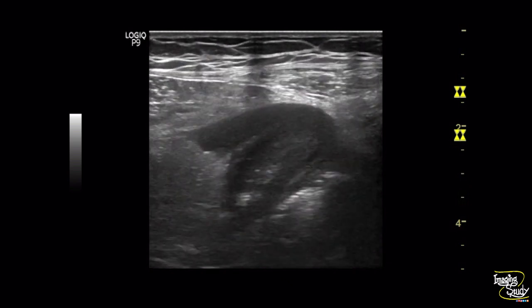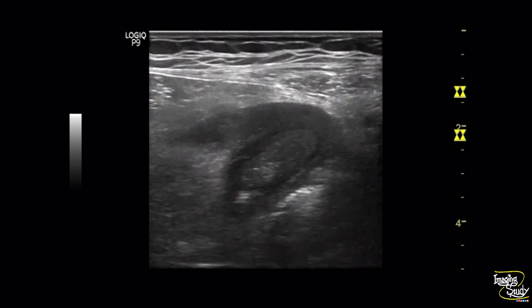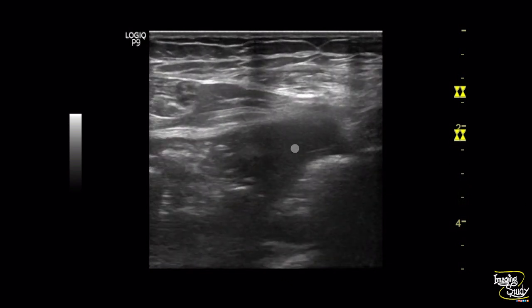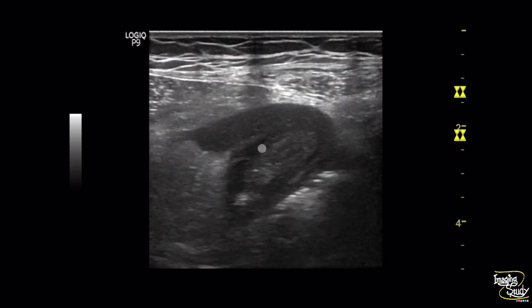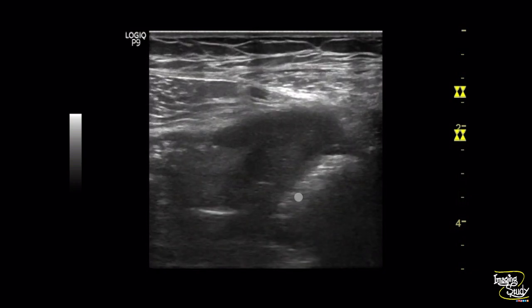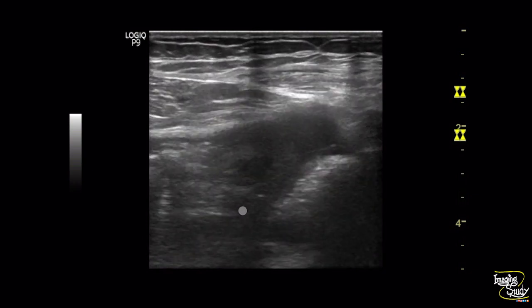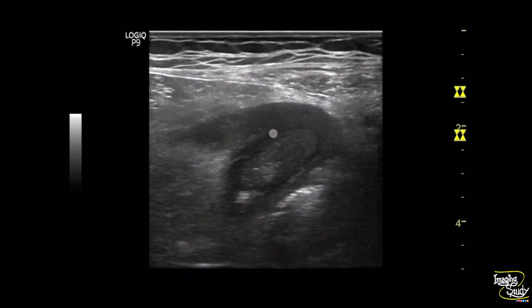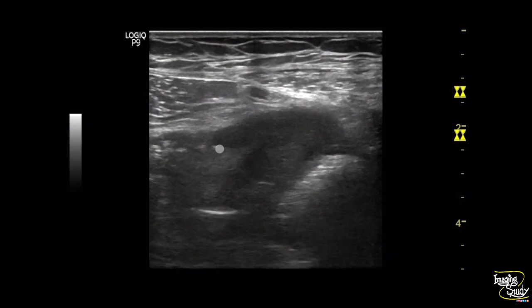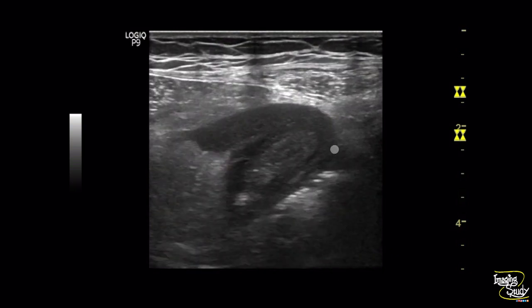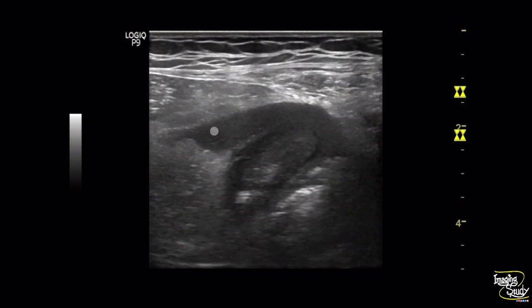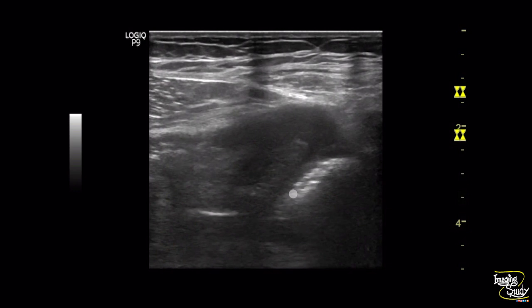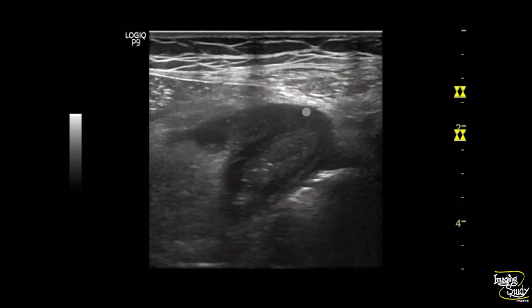But we searched this patient with a high-frequency linear transducer, and the right iliac fossa shows this appearance. You can see a tubular non-compressible structure at the right iliac fossa with surrounding fatty tissue appearing thickened. This is also a case of acute appendicitis.